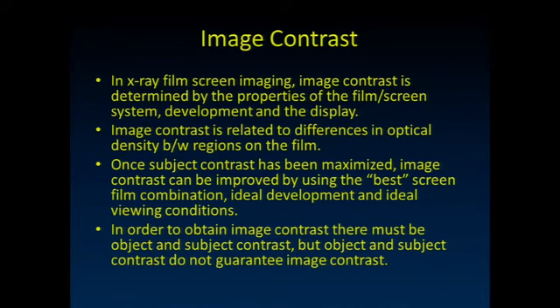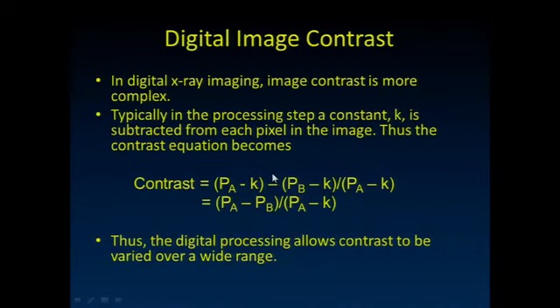In digital imaging, I can leave the development of the image out of the chain, right? With a piece of film, you can underdevelop it or overdevelop it. You could overexpose it or underexpose it, and that contributes a tremendous amount to the imaging chain, right? In digital imaging, we're much luckier.